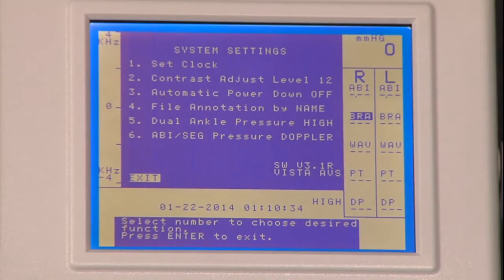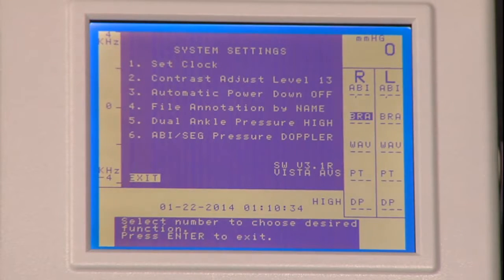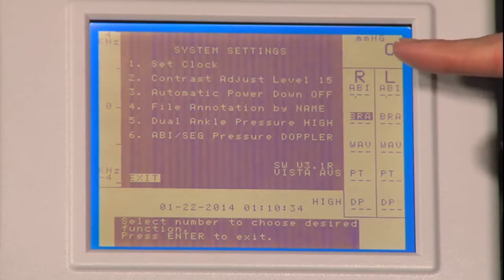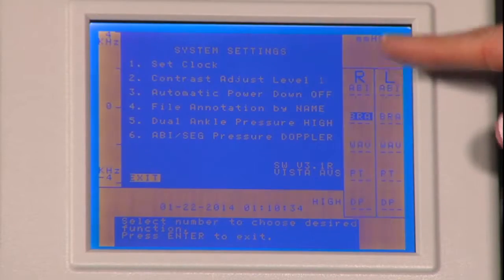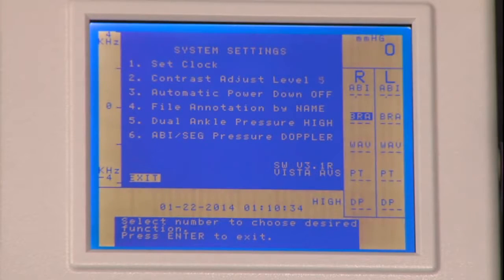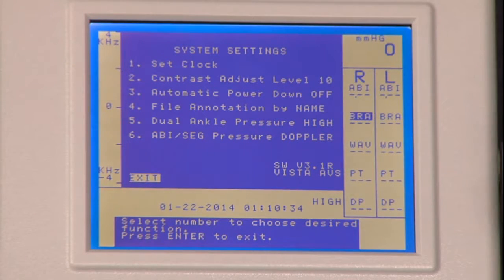Pressing number two for contrast adjustment level. As you continue to press number two, the level number will change as the brightness of the screen changes to your desired contrast.